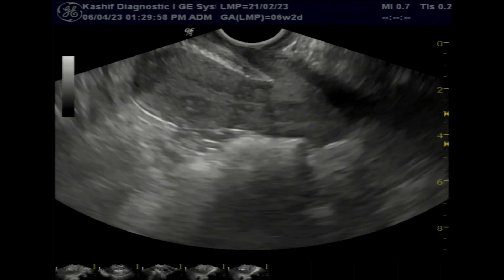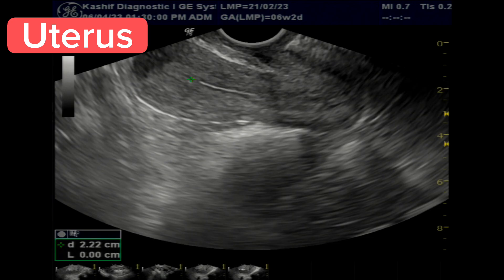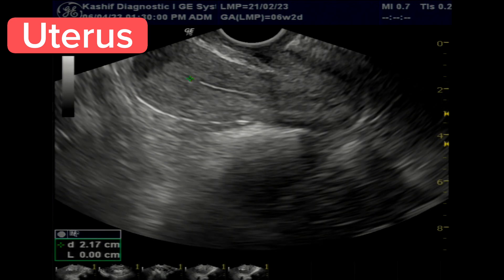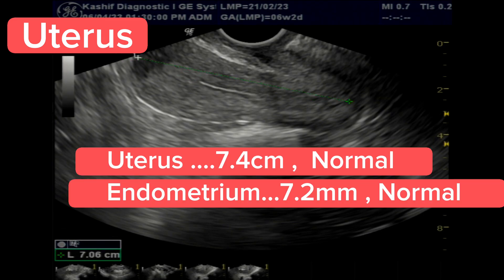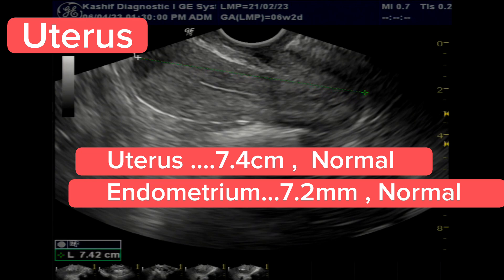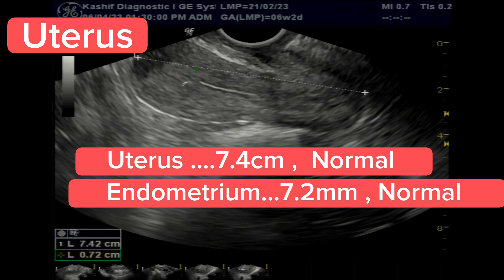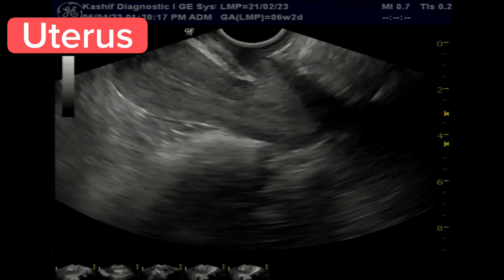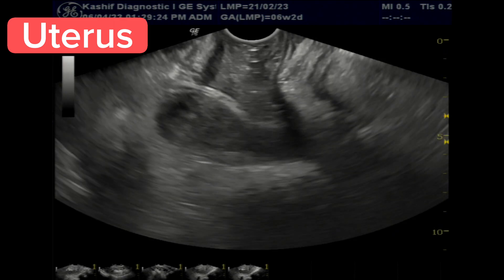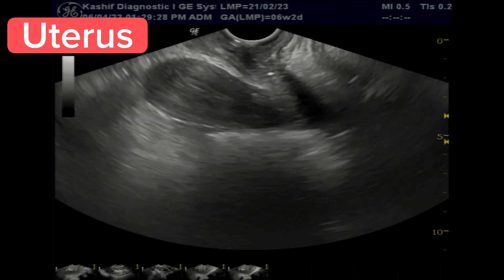The uterus is visualized and is normal in size. The endometrium is normal. However, if you look at this TVS uterine image, what is the difference compared to other normal TVS uterine images? This is a rare case which can only be diagnosed with TVS ultrasound. Note that the TVS probe is 2.71 centimeters away from the cervix.